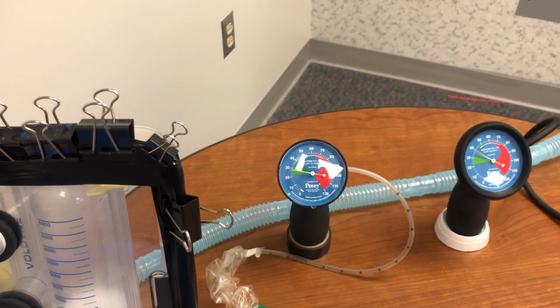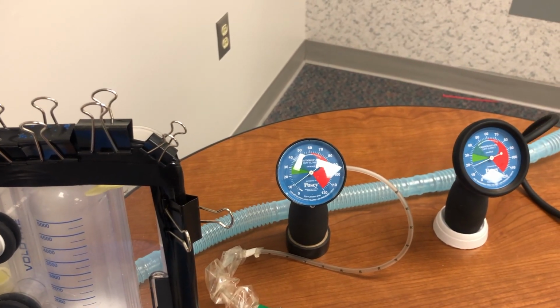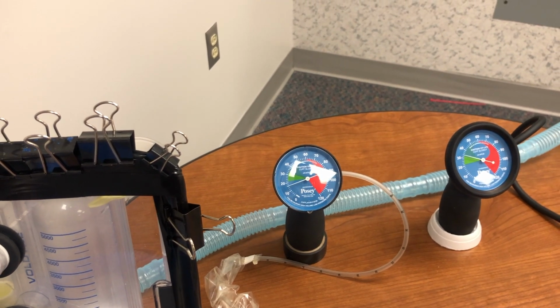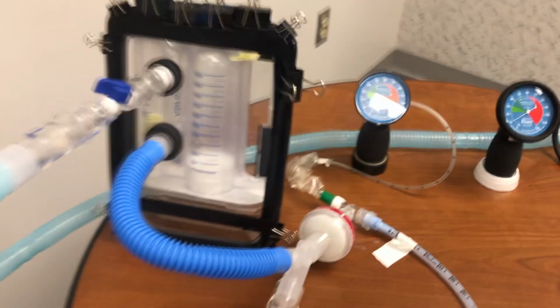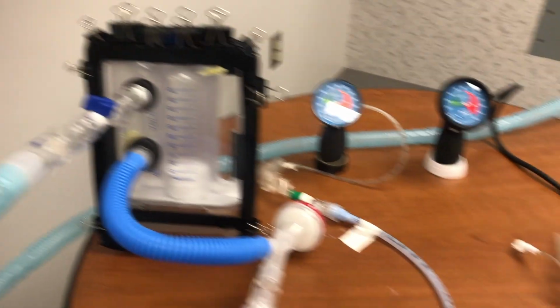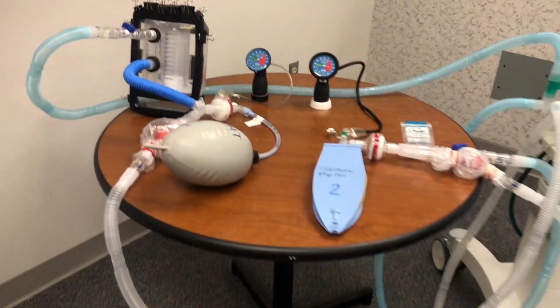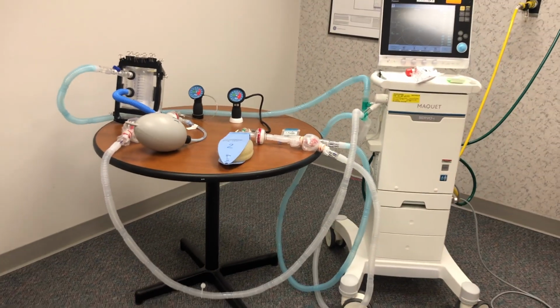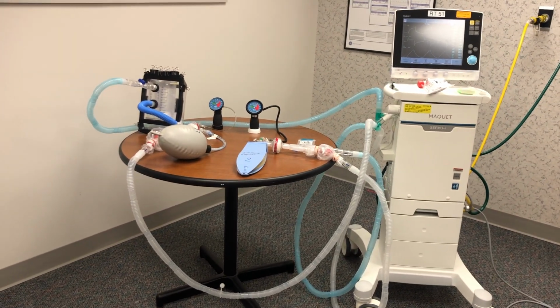And we can again control the pressure. So that is the key thing about these patients. If we ventilate them in this way, there's a way we can ventilate them with individual parameters.